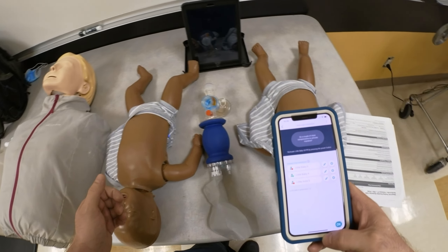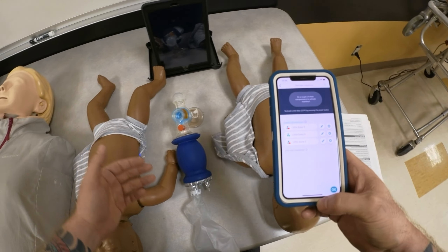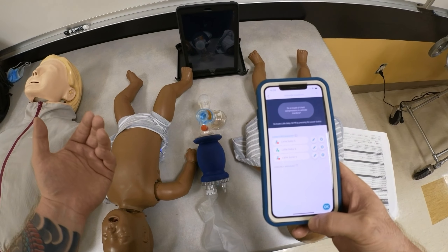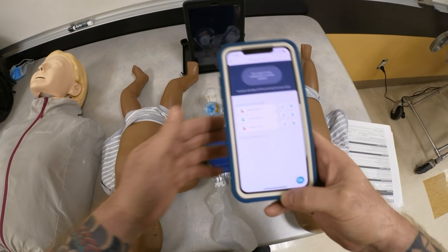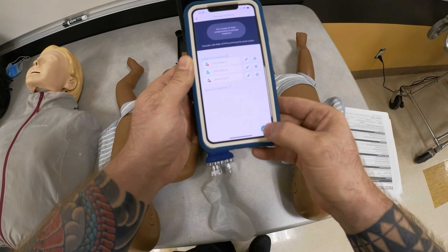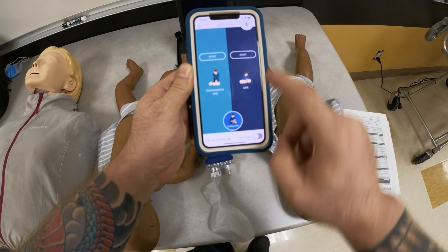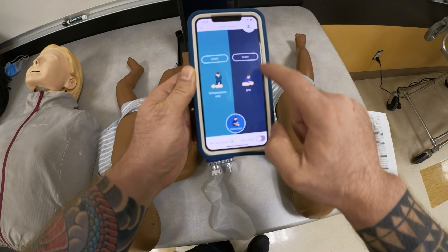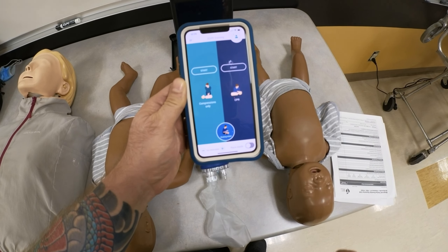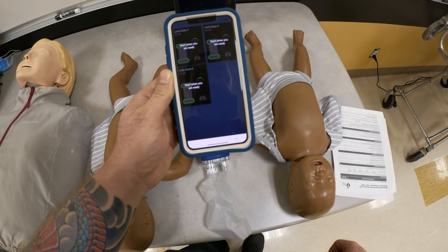When you're doing this with students, I advise you to use an iPad — it's a bigger screen so they can see their feedback while practicing. Once everything is connected, I click OK, set infinity minutes, select CPR, and click Start.